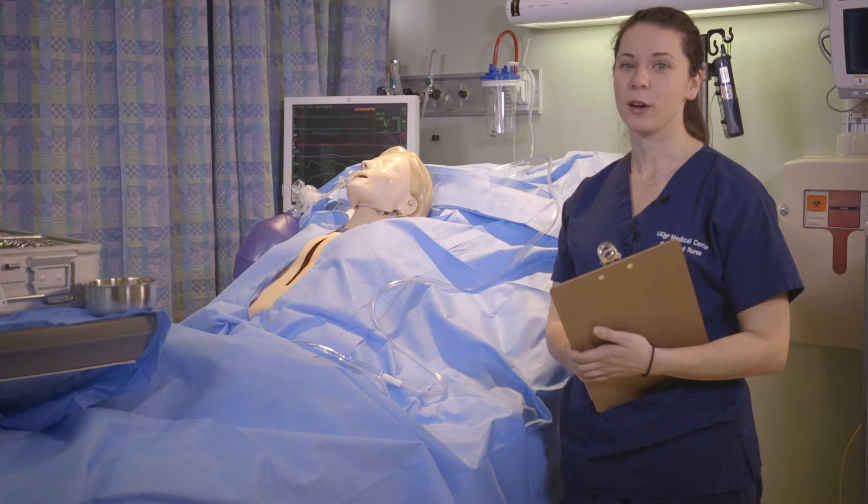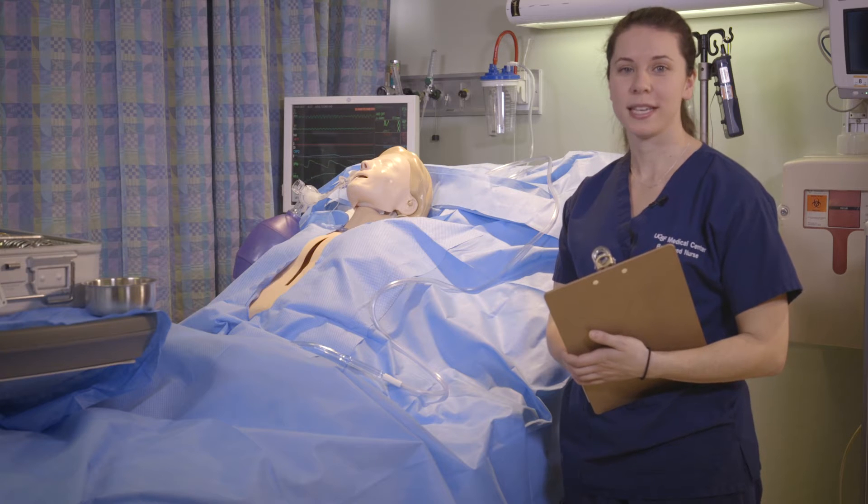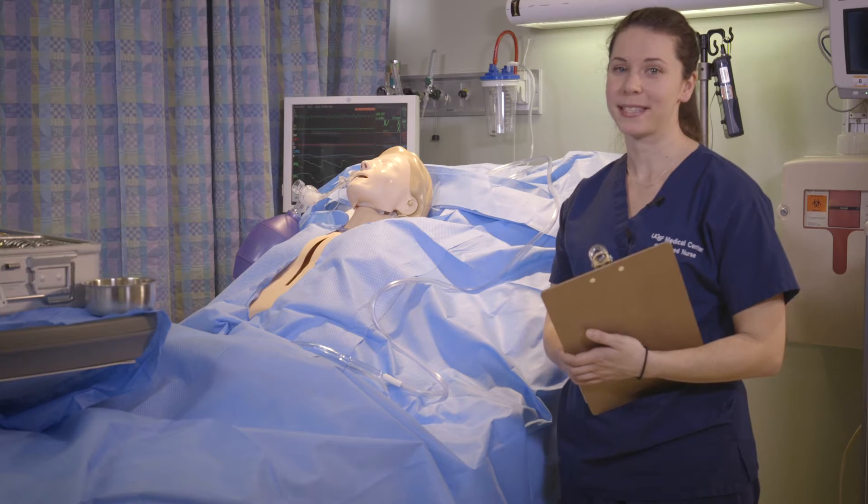Welcome to the 10ACC open chest simulation video. By the end of this video you will have learned proper sterile technique, how to prepare the sterile field, and how to assist in an open chest emergency at the bedside.